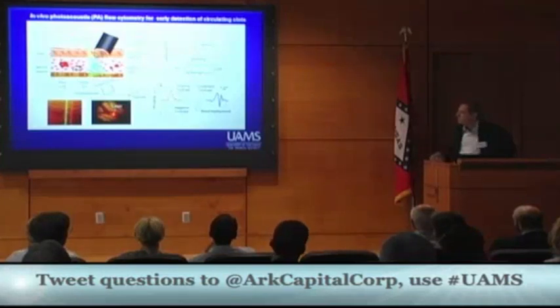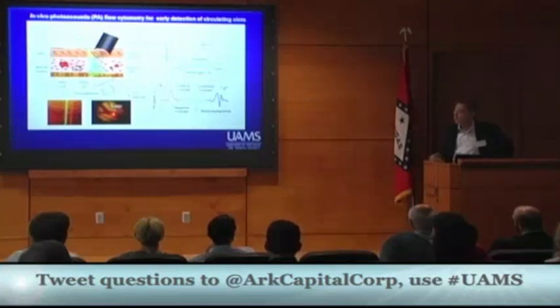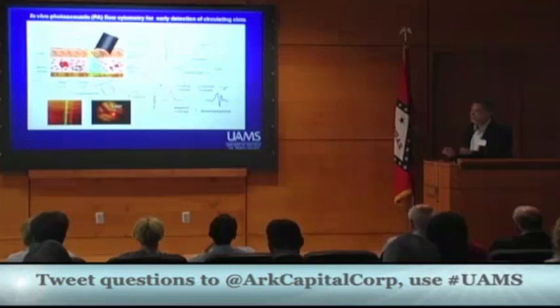But after many years collecting data, you focus on research, what we found? It's related with clots. Because when clots are inside the laser beam, no absorption, no any signals. That's why instead of background signals, we have nothing. We call it dark spot or dark contrast or dark mode. That's why it's very easy, it's very simple.